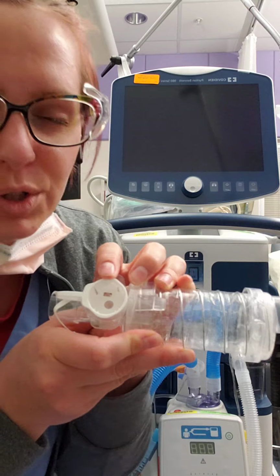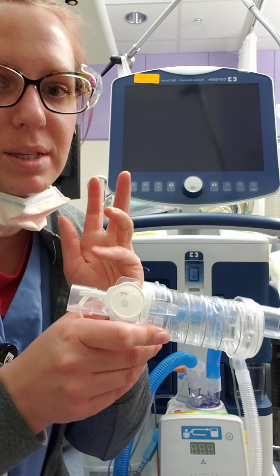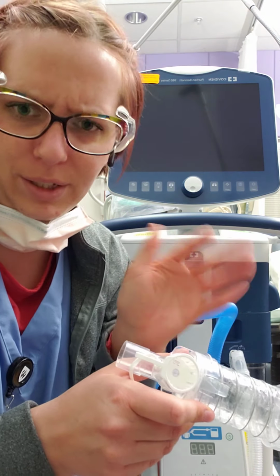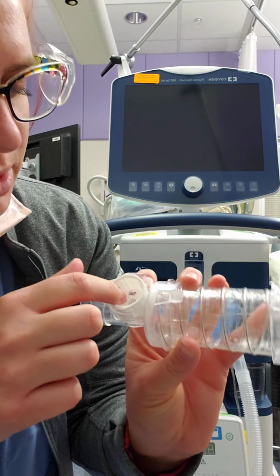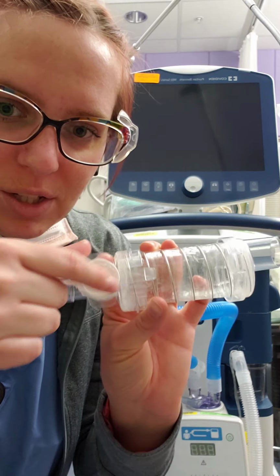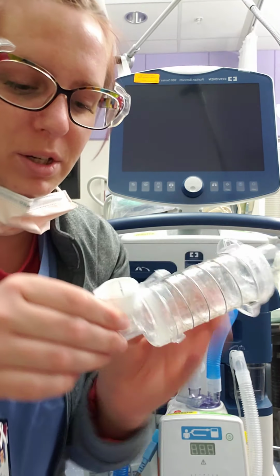MDI. So this is universal. You can use it on basically all metered dose inhaler medications. There's a few specialty ones, but the basic Symbicort, albuterol, Ventolin, any of the major brands, this will universally fit. So if it fits in there, there's a little hole in which you will take the MDI canister, match it in there, and push down to actuate for the patient.